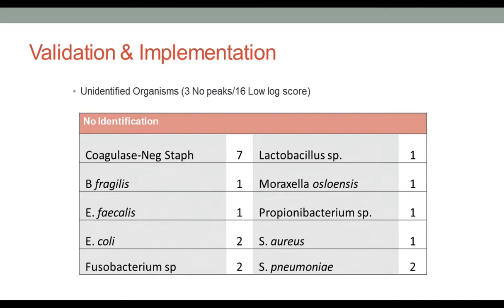That's what it says in the procedure or the package insert from the kit, but we don't typically use that. If you look at the organisms that we isolated, we would not normally need to do that extraction method based upon the organisms that we're isolating from our blood cultures.